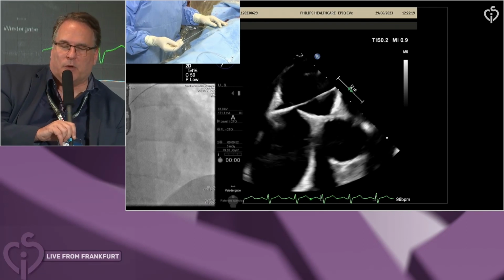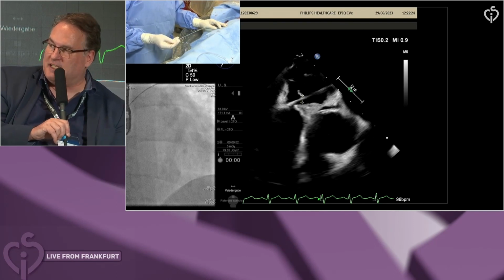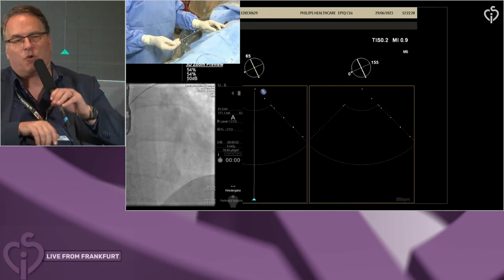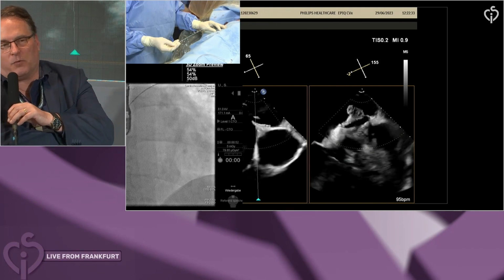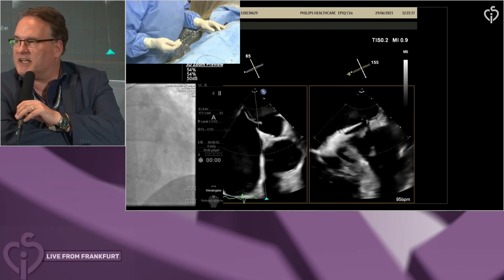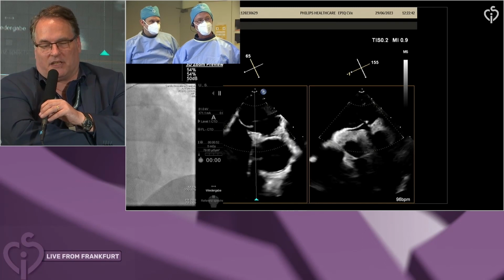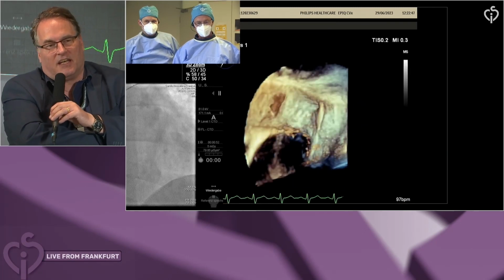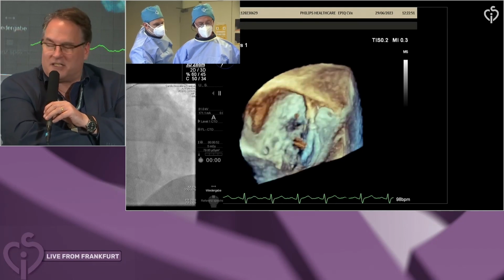Yeah, we pre-estimated a little bit the balloon, and you've seen in the other case that the excursion of the membrane was pushed up more than 1 centimeter. The base was 18, which is the disc size of a normal PFO occluder. So all those are components that push you into balloon sizing and also into use of an ASD occluder in the first case. But this is totally different. I think you see a very nice rim here in the 45, 60 degree view, which will hold the disc very nicely on the right atrial side too.